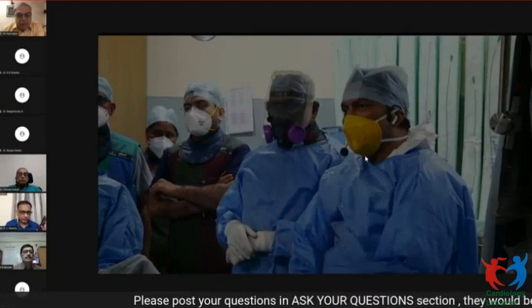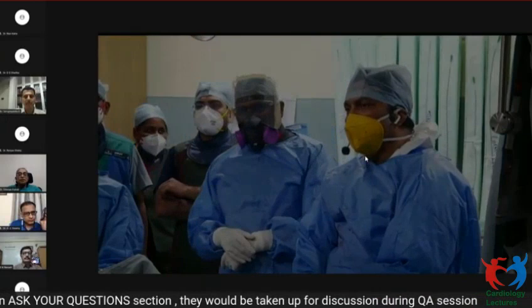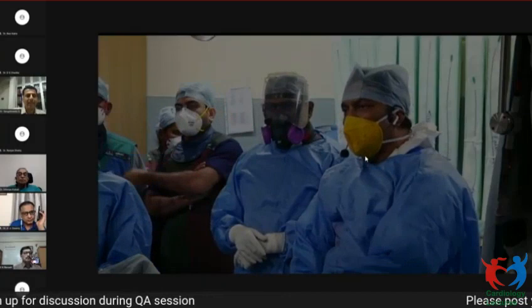So then we put the two wires and there is an LAD bifurcation lesion. What is the next? First, kindly, Dr. Kosturi, you go to the LAD images. Very nice to know of the LAD D1 bifurcation. Not able to hear it.